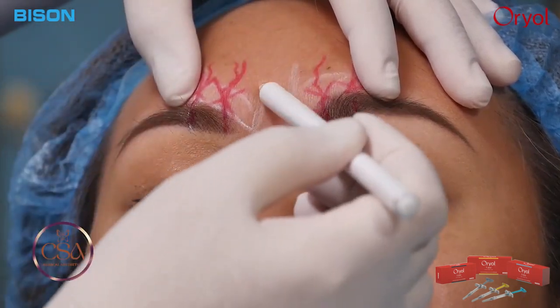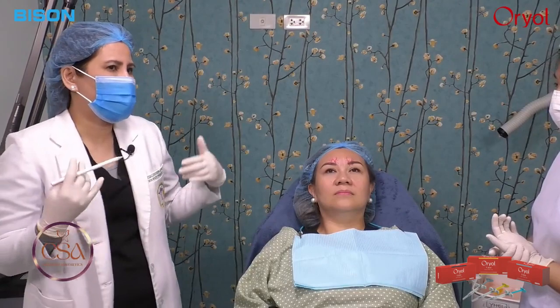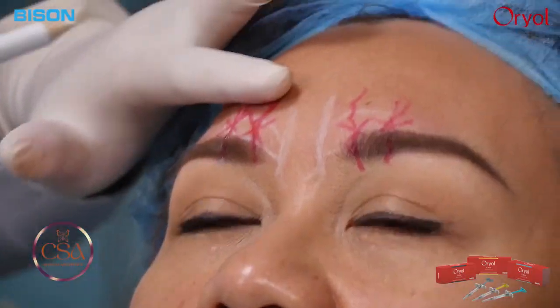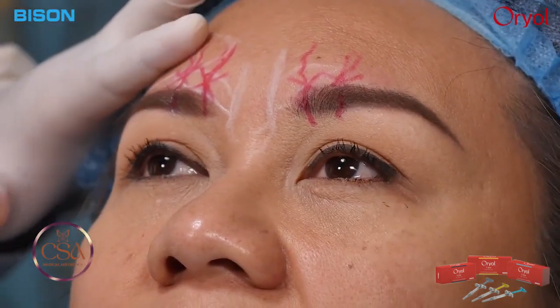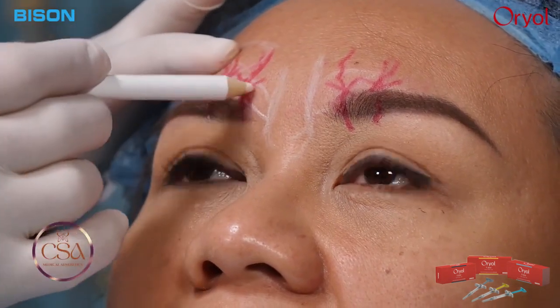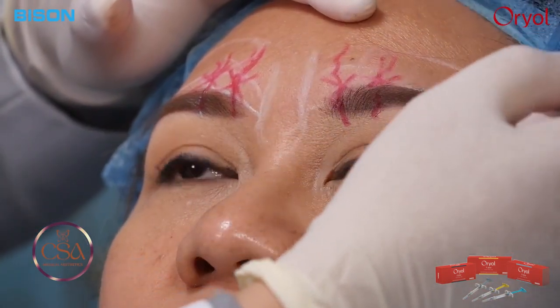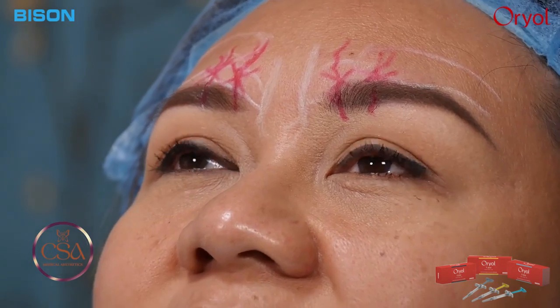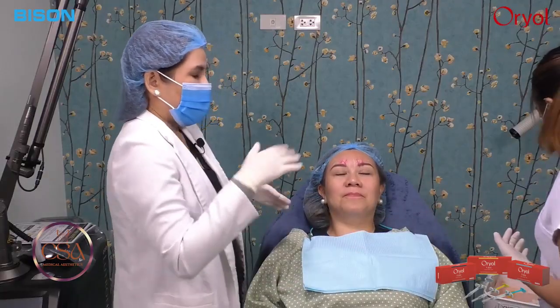Okay, now in doing filler injections, we either use needle or cannula. You can use needle, you can use cannula. Actually, there are other cases where we do filler injections in this aspect here when they have a sunken inferior forehead. We use the cannula method because we have these blood vessels here. So on the periphery, the inferior aspect of your forehead, if you have a volume loss, you can use the cannula method there. Okay, Ma'am Maureen? Yes. A little bit of anatomy review there. And right now, we'll do the procedure.